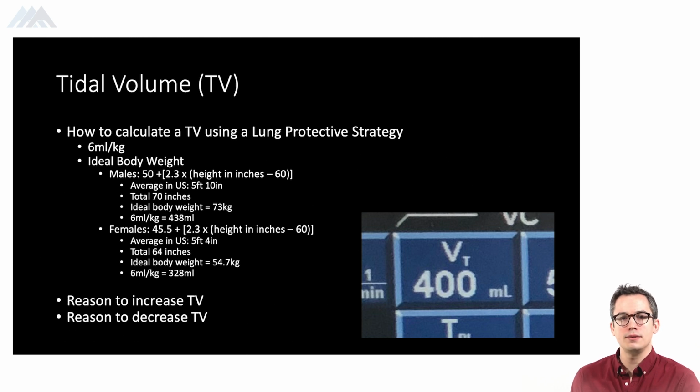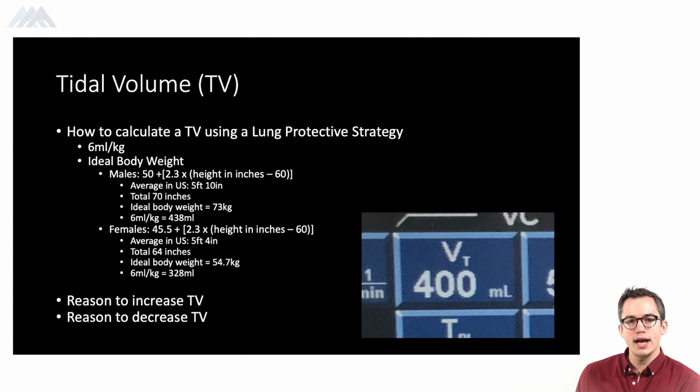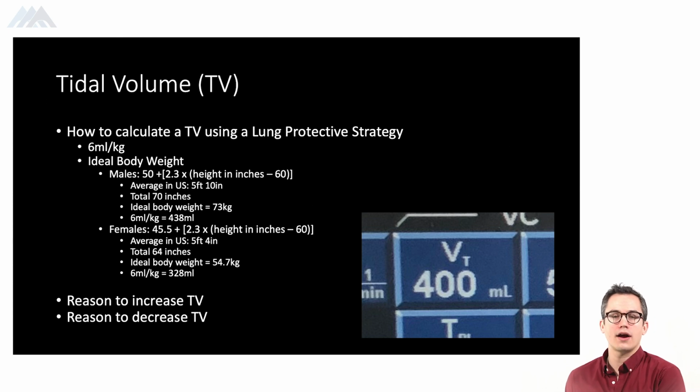Tidal volume is going to be the amount of air in mLs that is instilled into the lungs. The equation that I want you guys to use for this is a lung protective strategy, and that's going to be 6 mLs per kg. When we're figuring out their weight in kilograms, we want to make sure that we use their ideal body weight, not what their actual weight in kilograms is at the time that you are taking care of that patient.